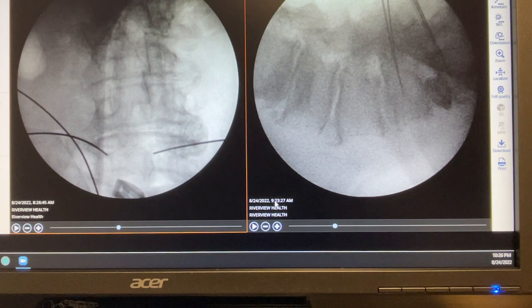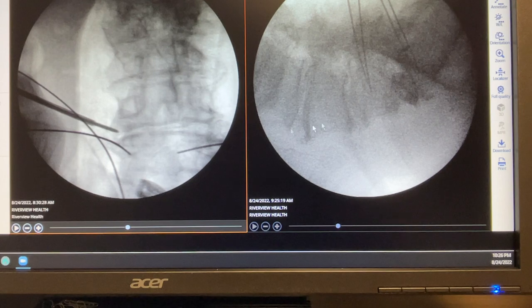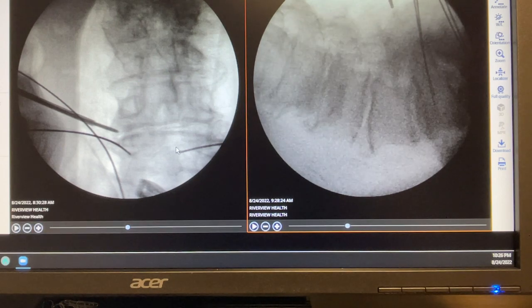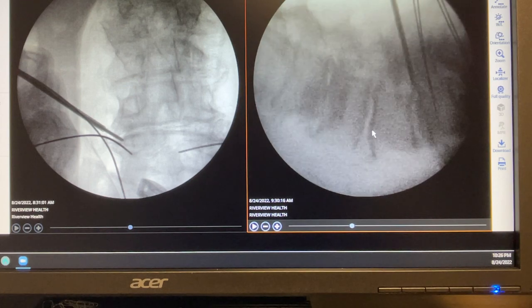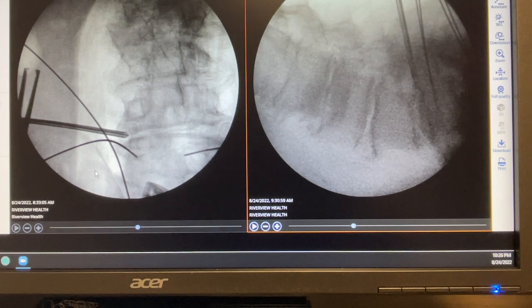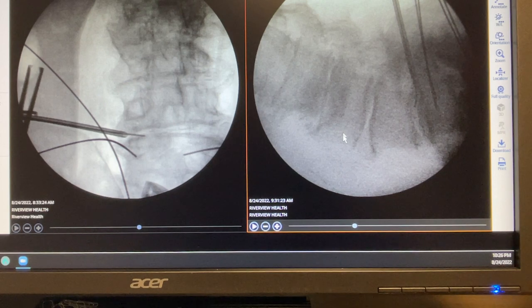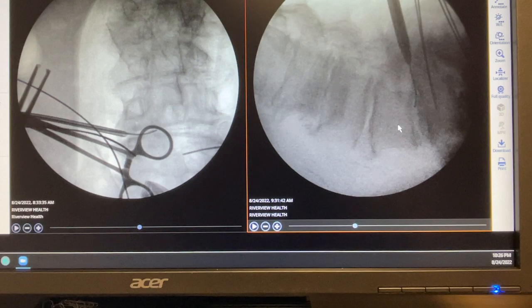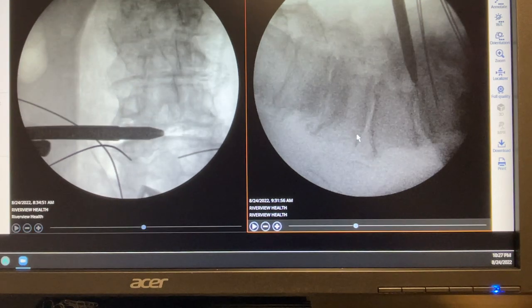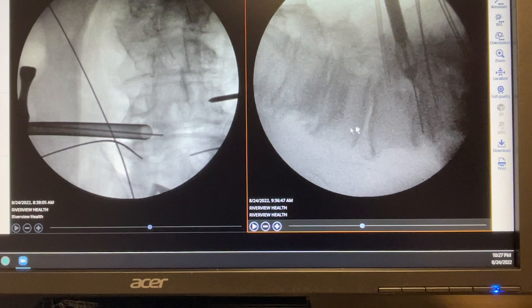This is less than 25 minutes after surgery started. We then pay attention to L4-5, a very sclerotic and very collapsed disc. Using the neuromonitoring probe, I'm able to enter and then place a K-wire. The front of the K-wire has been bent so that I can steer it into the disc space, because the disc is so collapsed and sclerotic it's very hard to get anything in. We open up the space, correcting the minor scoliosis the patient has, then the cage goes in.